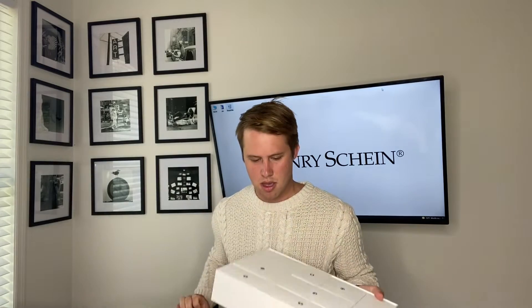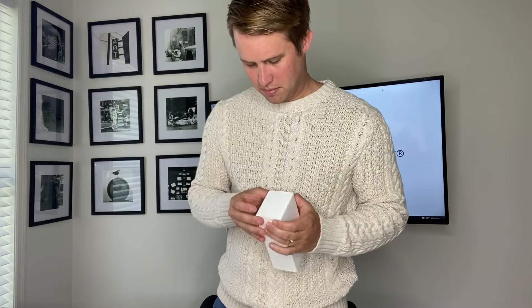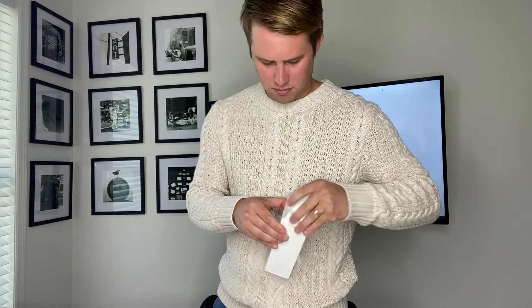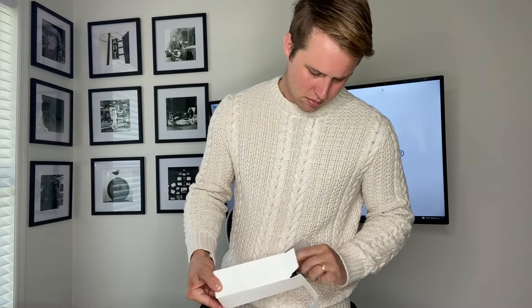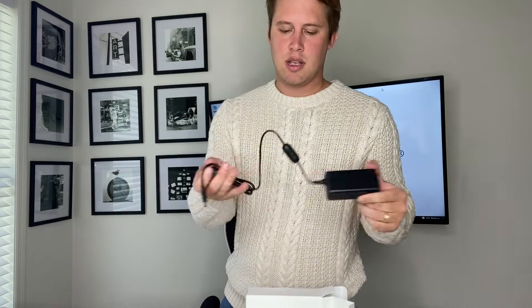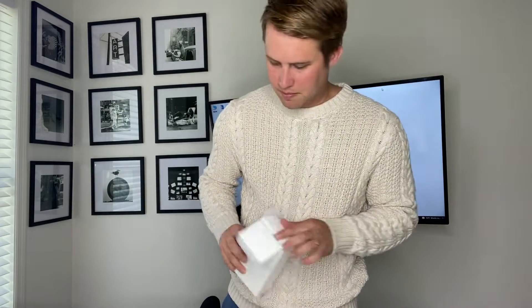There's an array of accessories here. Let's start out first with what appears to be the jack - this is likely the connection hub that powers the connection between the scanner and power source. We have our jack, and what looks to be our calibration tip here.